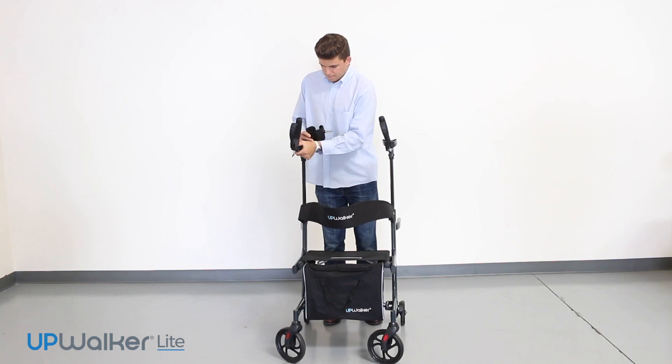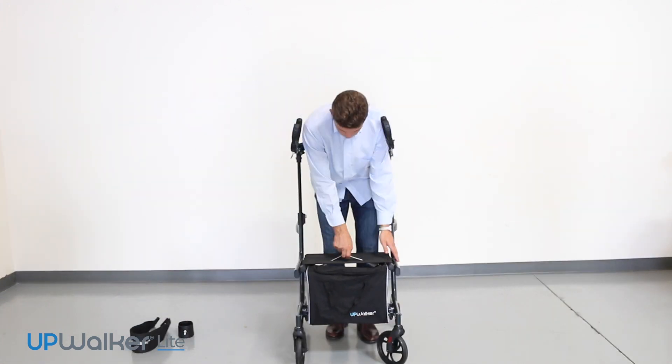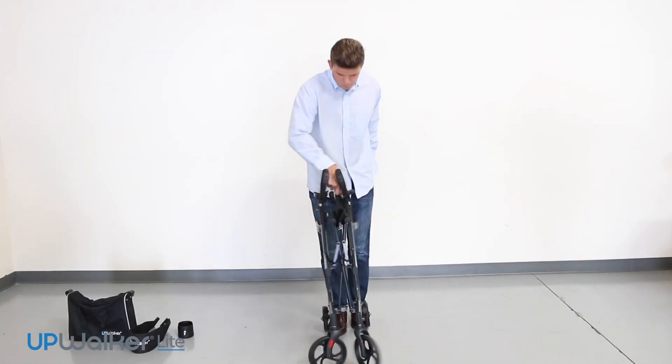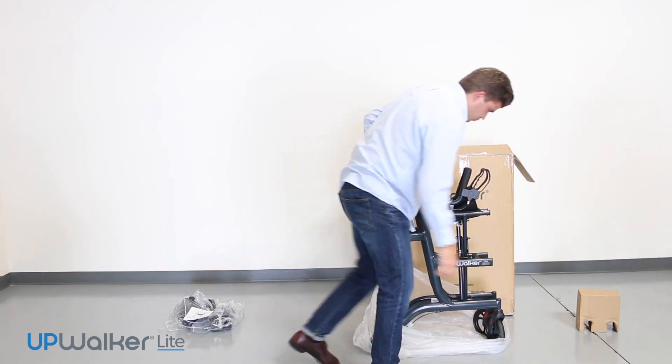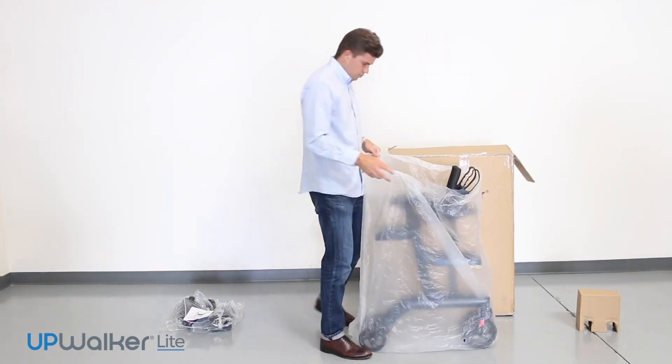If for any reason you need to return your UpWalker Light, you will use the original packaging materials. You will put the UpWalker Light back into its original plastic bag, sliding the unit wheels first into the box.